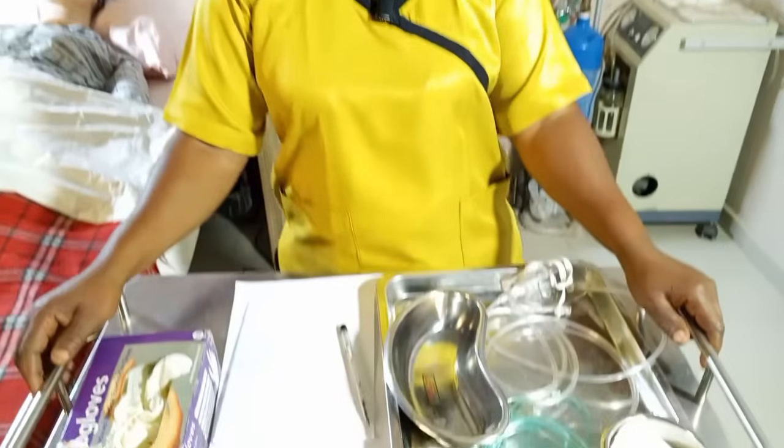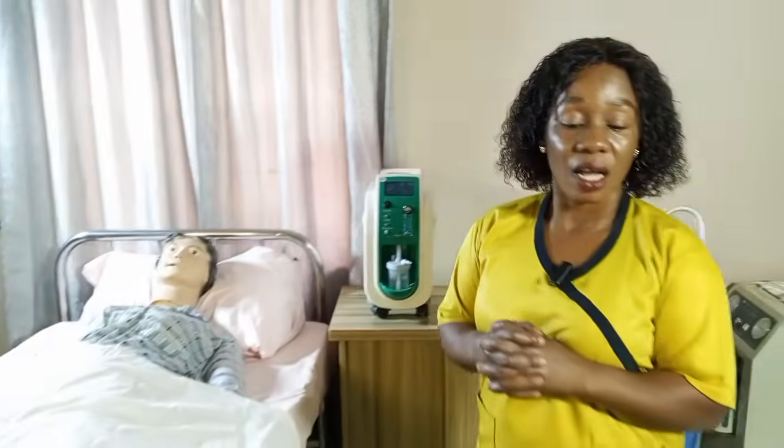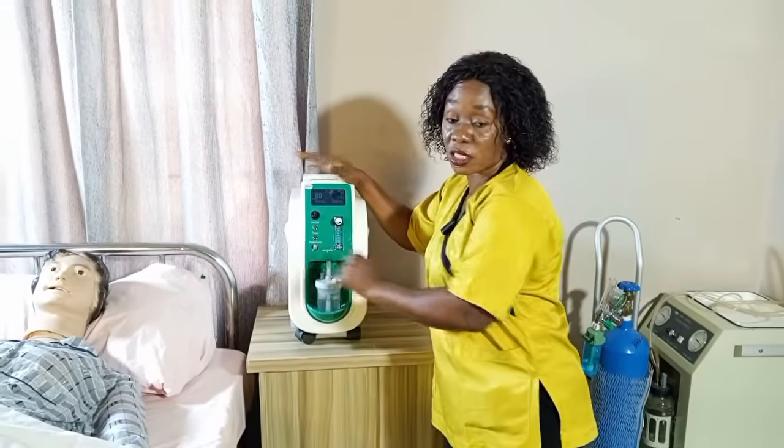In today's episode, we are going to look at oxygen administration. Remember that oxygen administration occurs when the patient is having difficulty in breathing, or has trauma, or has disease conditions like asthma or congestive cardiac failure. Today I am going to use this oxygen concentrator to administer the oxygen to my patient.